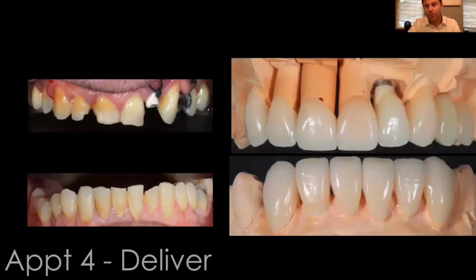And so we did the bottom 6 veneers and the top restorations with the implant crown for the external hex. And then the cantilever is over here on the right, as you can see, so that while the implant heals on the top left, tooth number 13 is acting as a cantilever. Eventually we'll section that.